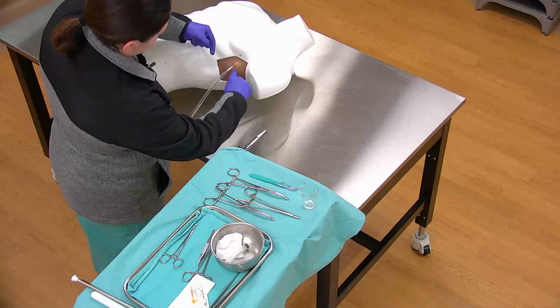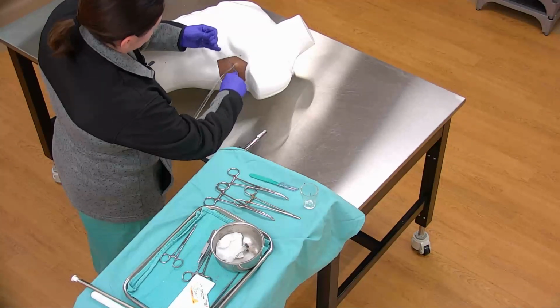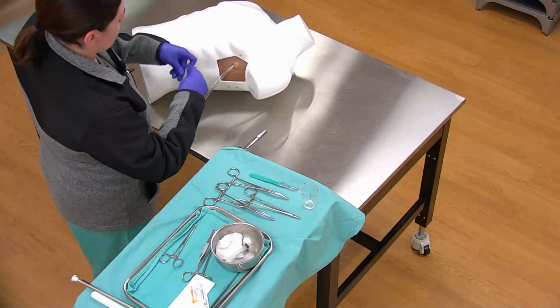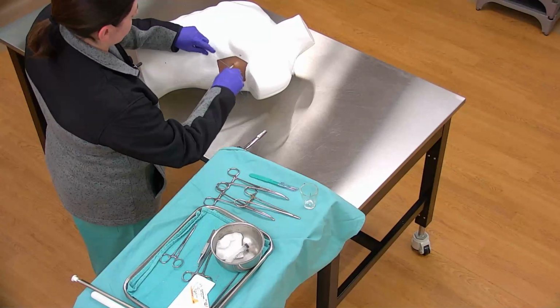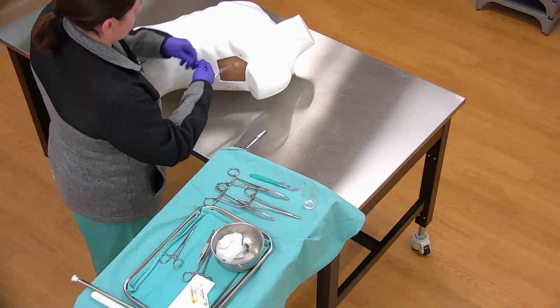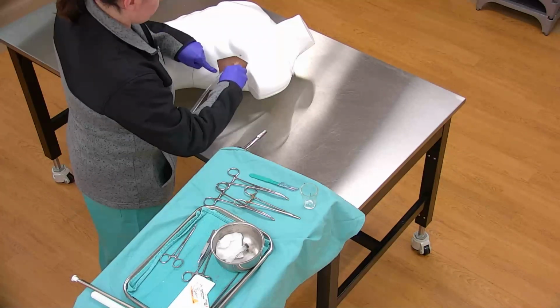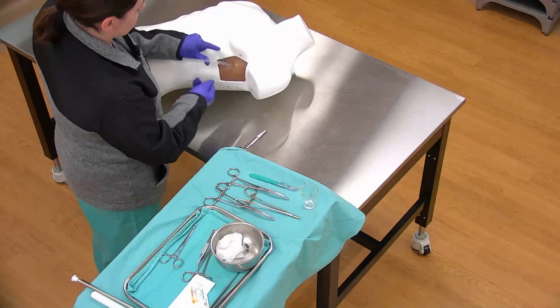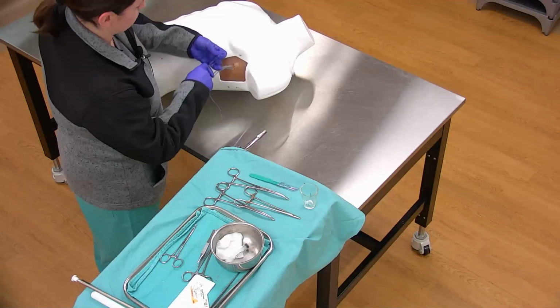For me, I tie a simple knot to close down the skin space first. And then I connect this suture to the chest tube. When I tie my knots, I tie quite firmly and I try to indent the chest tube. You'll never really occlude the chest tube, but if you tie firm enough that the chest tube indents as you tie your knots, it's probably tight enough and the chest tube will not slip from within your suture.